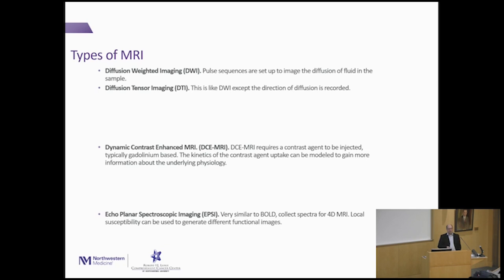and probably about 8 or 10 years ago, there was a famous DTI study with monkey brain, and it preceded the Connectome project where they imaged human brain, but this was a monkey brain, and they used DTI to show all the neurons and the nerve fibers and the directions that they go, and they're all color-coded based on the direction they go.